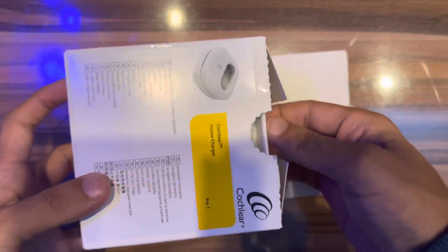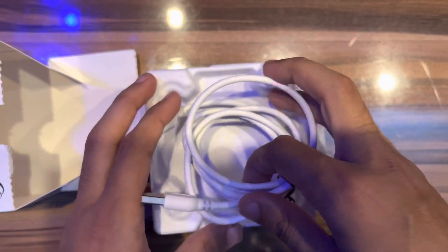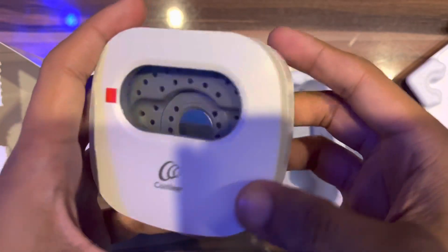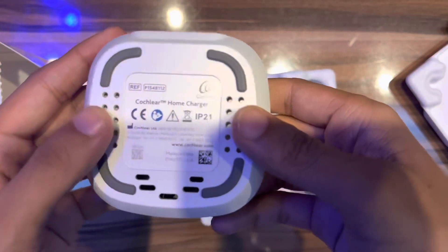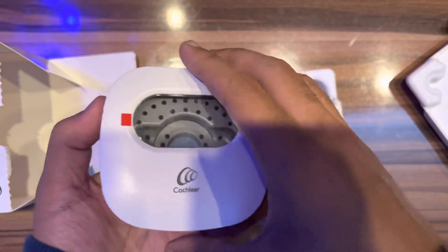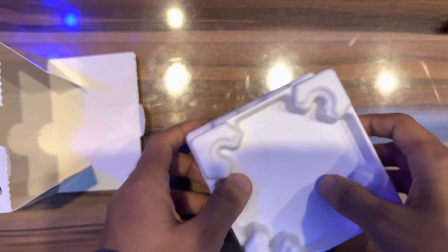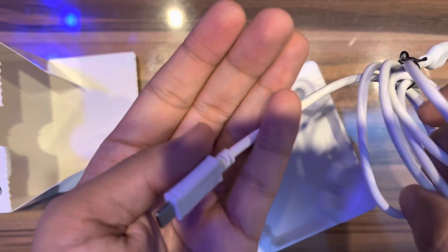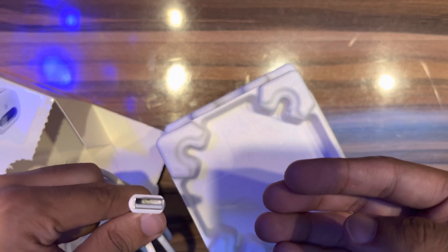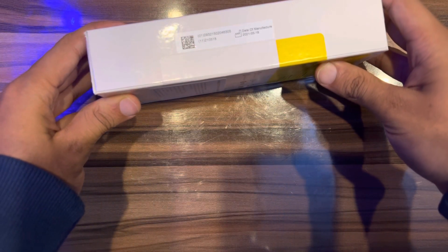The last two unboxing items: this is a USB Type-C cable and home charger. There is no different color, only white. Let me open this. The cable is USB Type-C to USB Type-A.